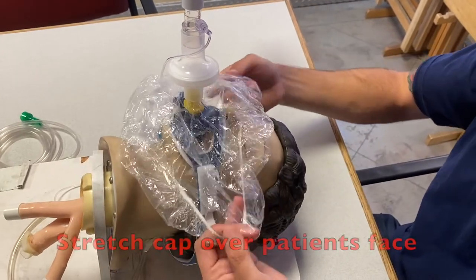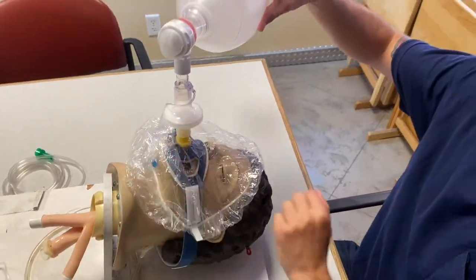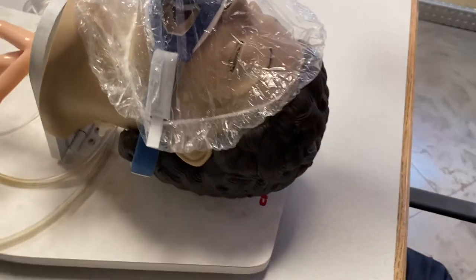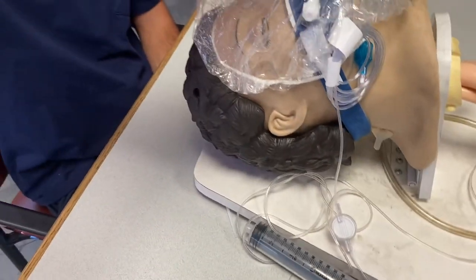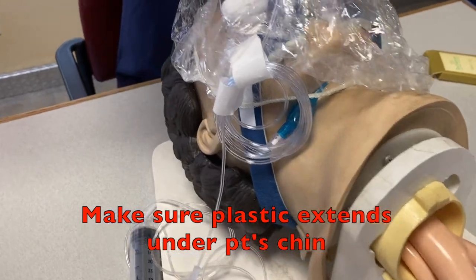That automatically locks the plastic into the area — it won't come off now. It's completely attached to the BVM and the tube. Go ahead and take the cap and stretch it over the patient's face and begin ventilating. You'll notice that the elastic of the shower cap creates a decent seal around the patient's face. Make sure that you extend it all the way around the patient's chin to lock it in and make sure it doesn't move.